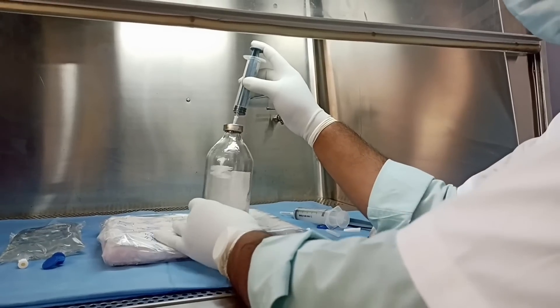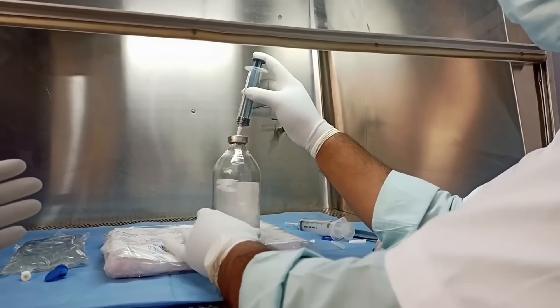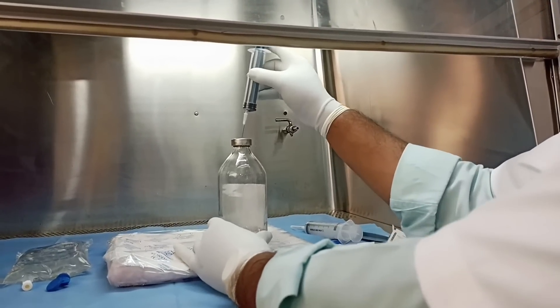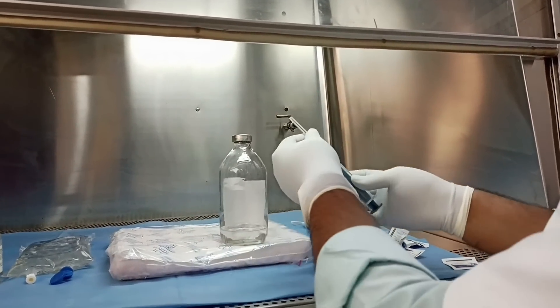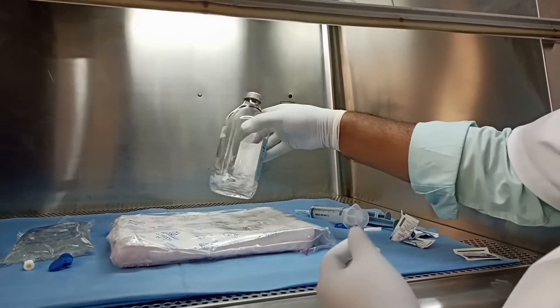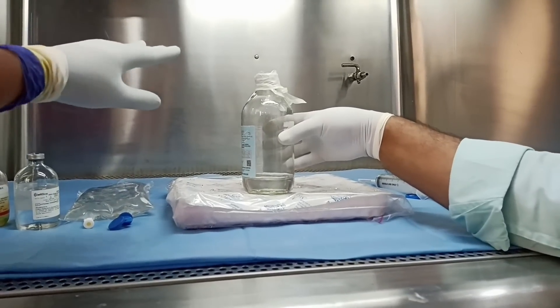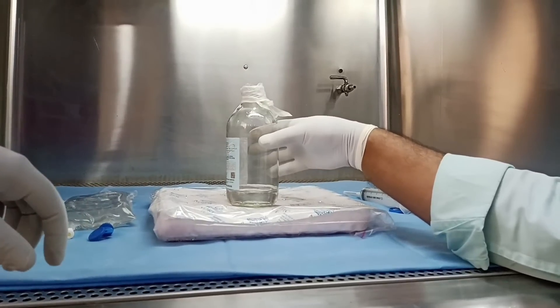We have transferred all the DMSO inside the glass bottle and have been continuously shaking it. Now we will cover this bottle with a sterile sheet or micropore and then refrigerate it at 4 degrees Celsius for about 30 minutes before adding the albumin. As you can see, we have covered the bottle with a sterile sheet and are now placing it in the refrigerator at 4 degrees Celsius.